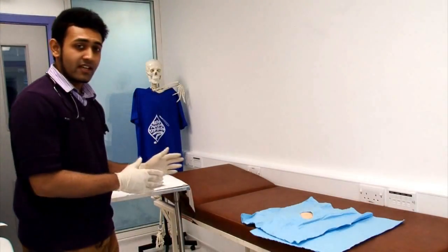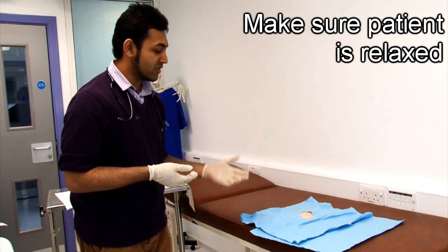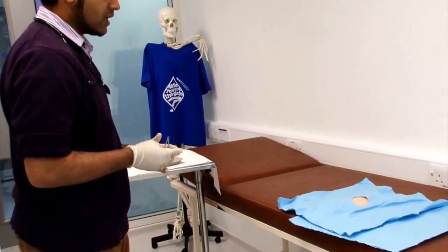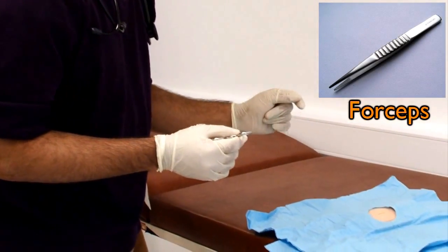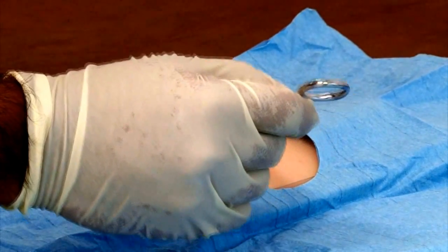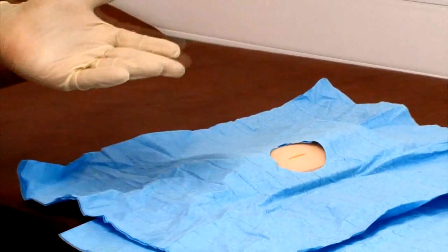Now we have the equipment ready. Before you begin, once again confirm with the patient — are they okay, are they in any pain, is everything okay with them. The first thing you do, after arranging your equipment, is take the forceps and tell the patient you're just going to feel around the area to make sure it is numb. Apply gentle pressure around the area and ask, 'Can you feel that? Do you feel any pain?' They should feel pressure but not pain. When they confirm no pain, you can move ahead.